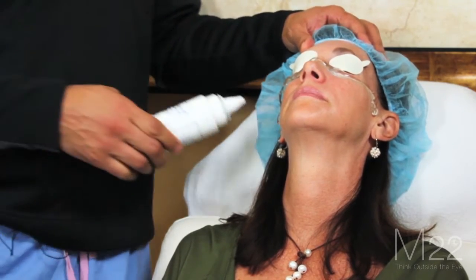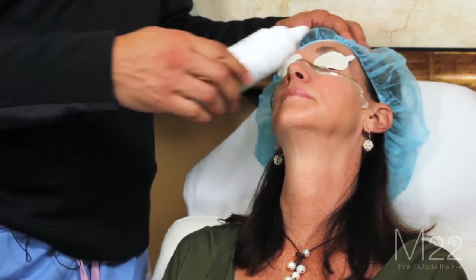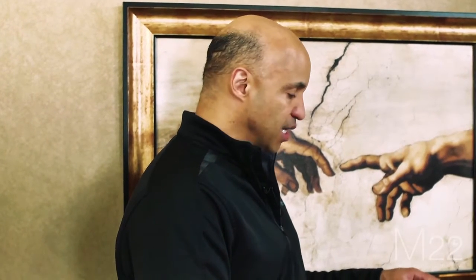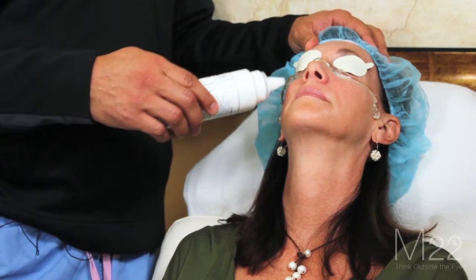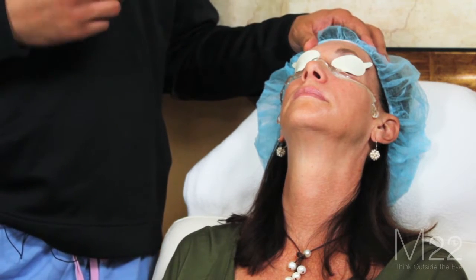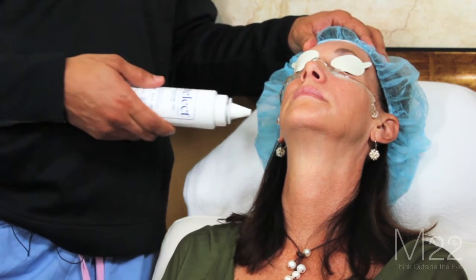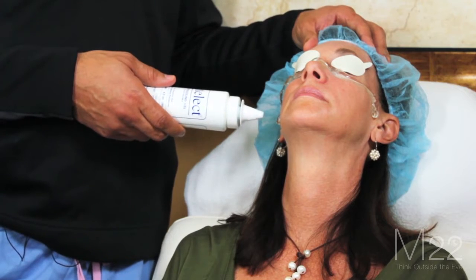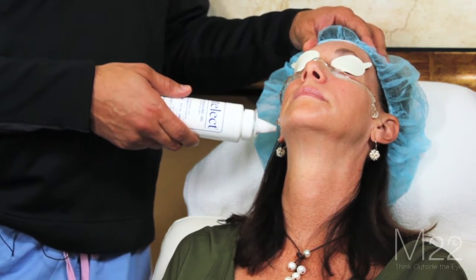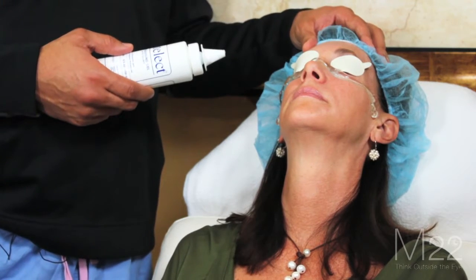What we're going to be doing is treating tragus to tragus. The reason we're doing that is when we were doing our studies, we found that if we just treat at the cheek level and the lid level, the ocular surface disease would come back quicker. Abnormal changes in the skin would also come back quicker. So treating from ear to ear got us better results.